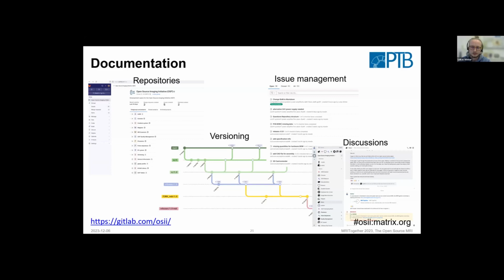Just so, an open source medical device doesn't mean that everyone can open everything up and change components. No, it's still fixed. And if you do that, then you just lose your approval, of course. There's a timestamp here, but this has to go with some versioning strategy as well.